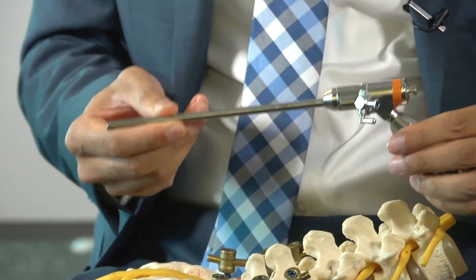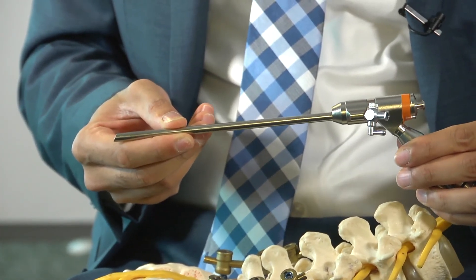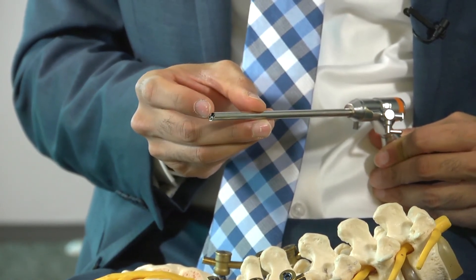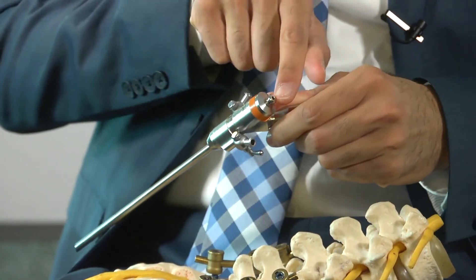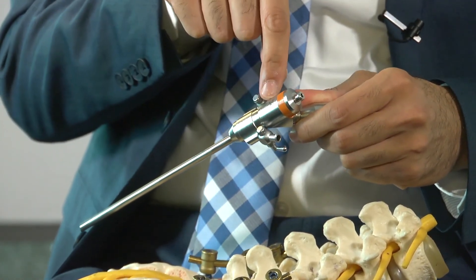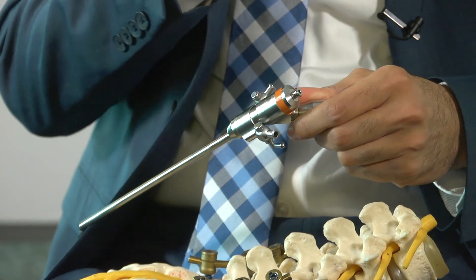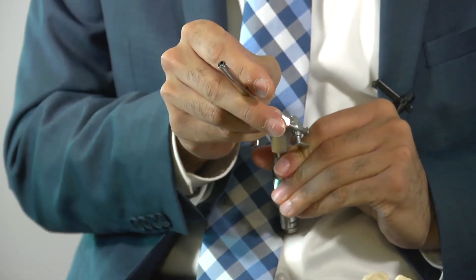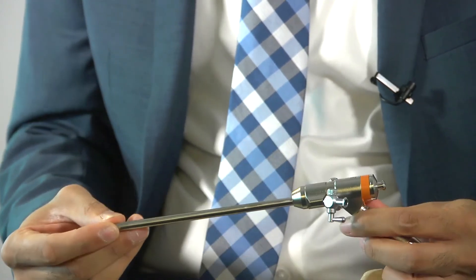This is an endoscope, which is what we use to do this procedure. At the end, you see a camera, and there's a small tunnel through which we can pass instruments to perform the procedure. I can remove disc material, and I can even go in and remove bone spurs — all done through the small camera. That's endoscopic spine surgery.